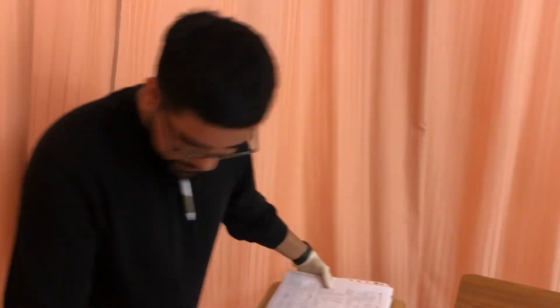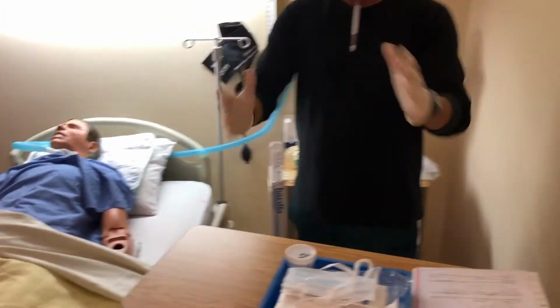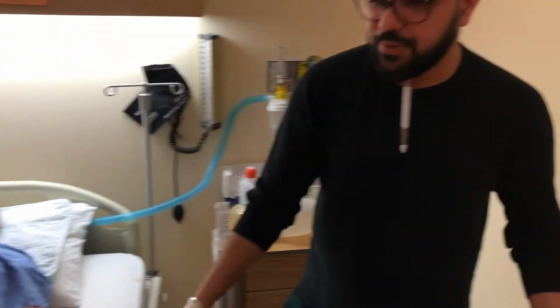Okay, so now we're going to go on to the trach part of it. So we could take our dressing tray here. For demo purposes, I'm going to be facing you guys. Otherwise, I wouldn't be facing the patient like this. I would be on the other side. But for demo purposes, I'm going to be doing it like this.